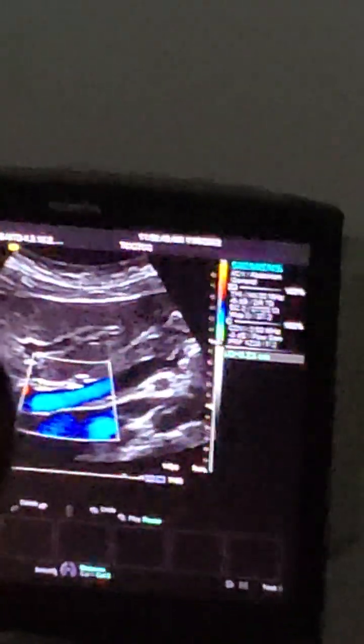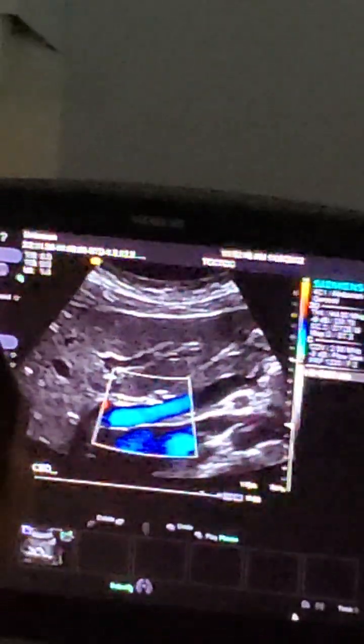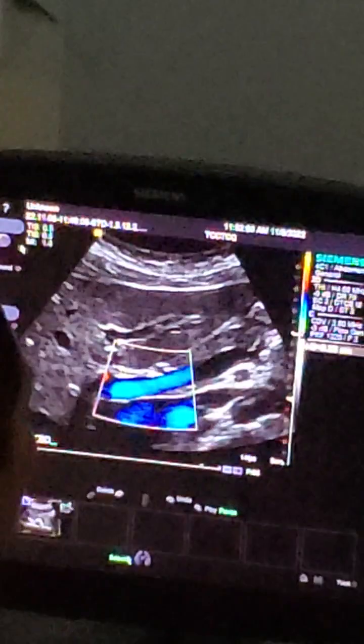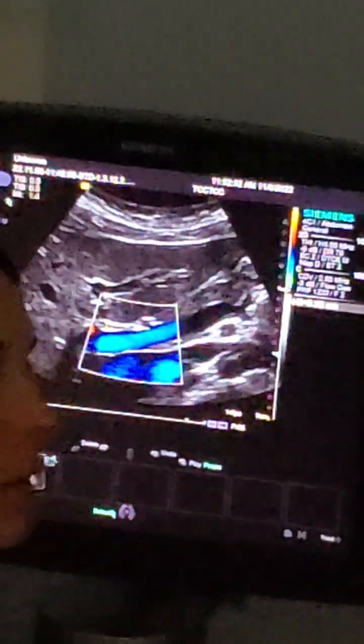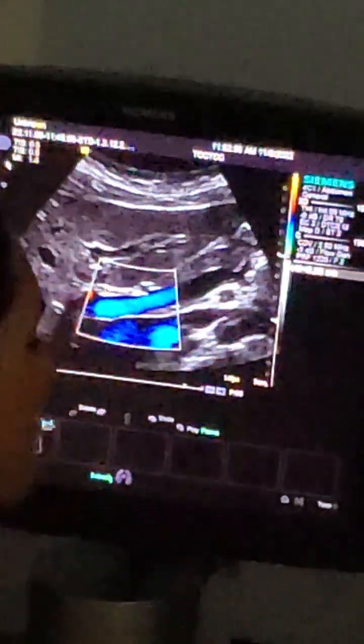Is that normal? A little bit bigger than... Nope. Or is it 0.5? So the book says 6 or less, and then at my work we do a millimeter per decade, starting at 3. So she could be 15 and still have a 3, but after like 40 you can have 4, and at 50 you can have 5.